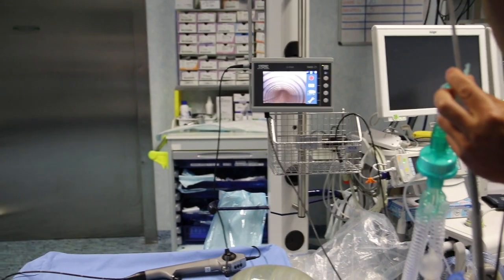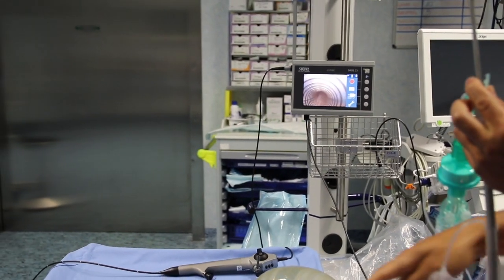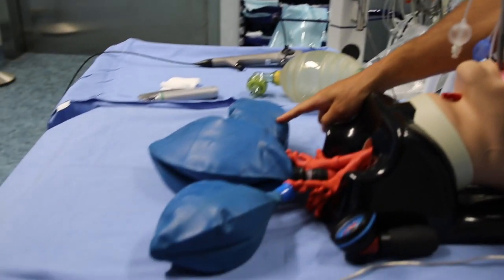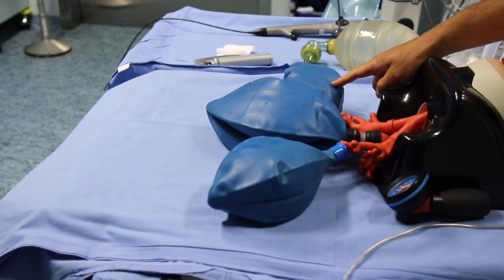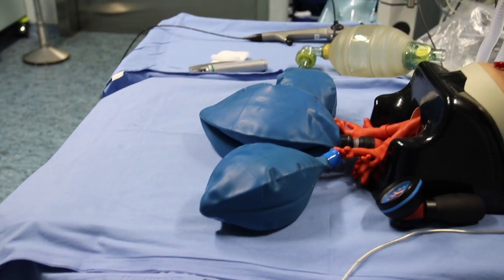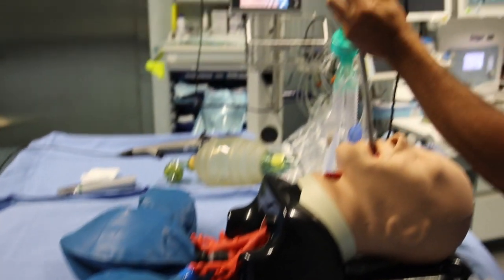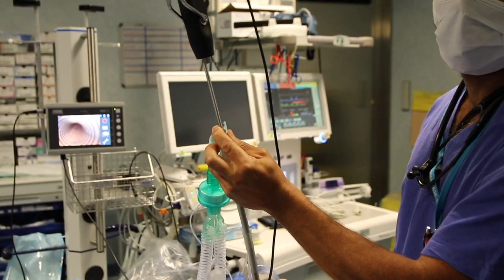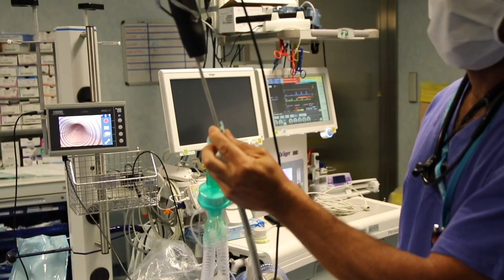Let me pause here for a second just to show you that the ventilation is still maintained, as you can judge by the mannequin's lungs. The pressure waveforms on the monitor screen can also be checked.